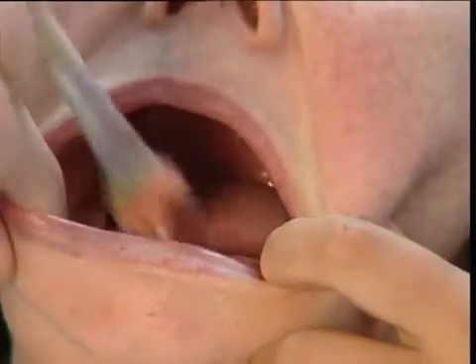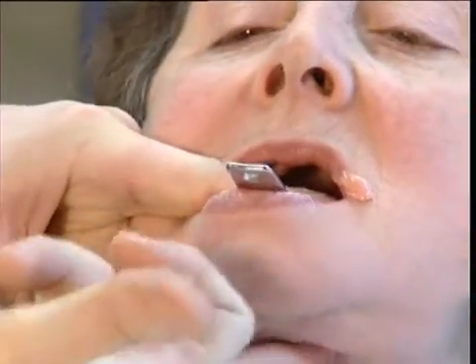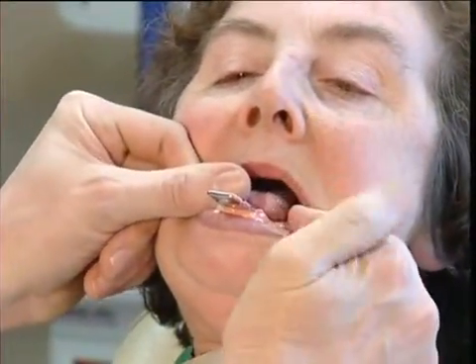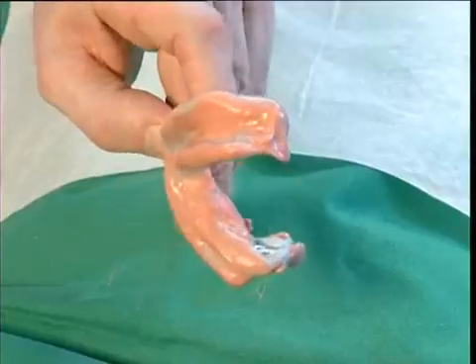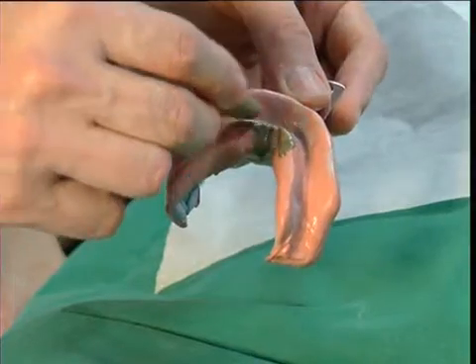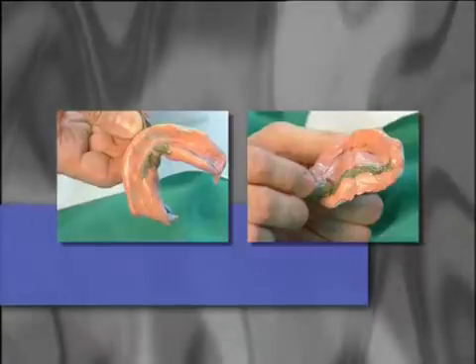The wash impression of the mandible is taken using the same procedures as shown for the maxilla. While doing so, the floor of the mouth should be activated externally and internally by the patient moving the tongue. This pre-functional anatomical impression is sent to the laboratory, where the model is used for fabricating a custom acrylic functional tray and the central fix registration instruments fitted into it.